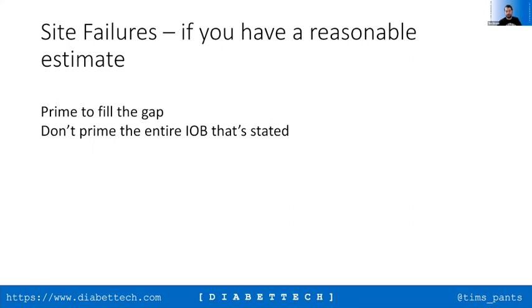Yes. So this is why it becomes about knowing the way the system works with you and what happens to you in relation to this kind of setup. So unfortunately, there isn't a good way of fixing this, and you just have to go with the old-fashioned ways of handling site failures as you would have done with a pump.